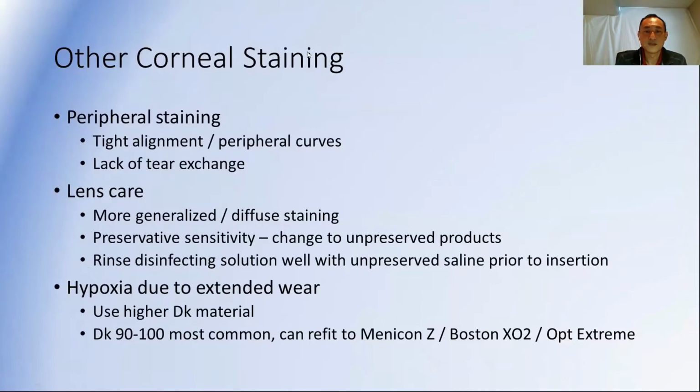Okay, so I think I answered the first question. Second question, minimum number of hours to wear the lens at night. I tell patients ideally 8 hours, but if they wear the lenses at least 6 to 8 hours, I think that's fine. You usually get enough treatment that way.